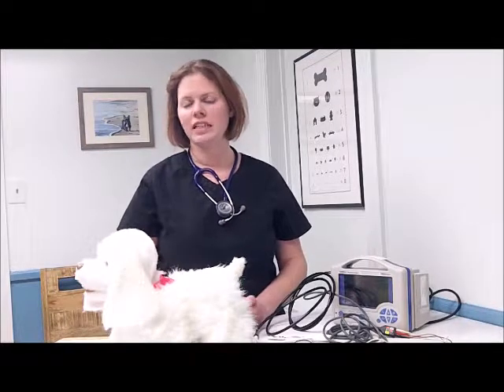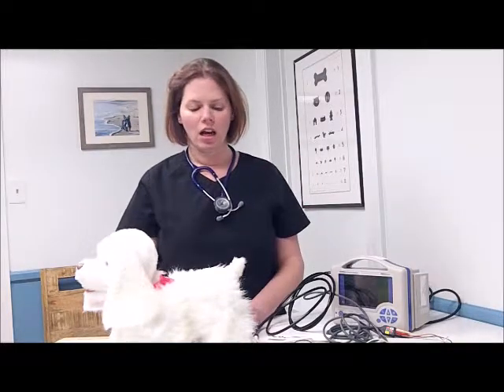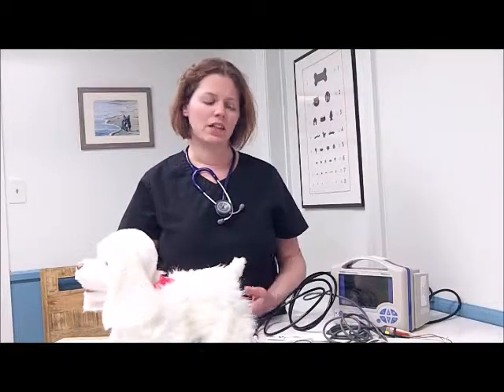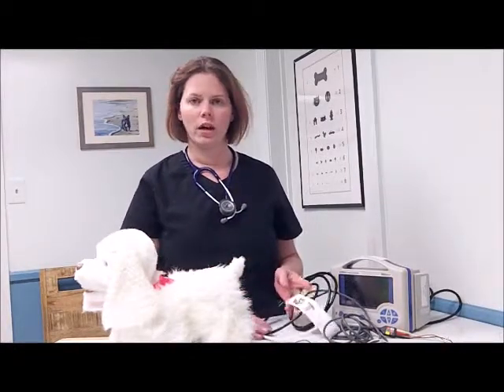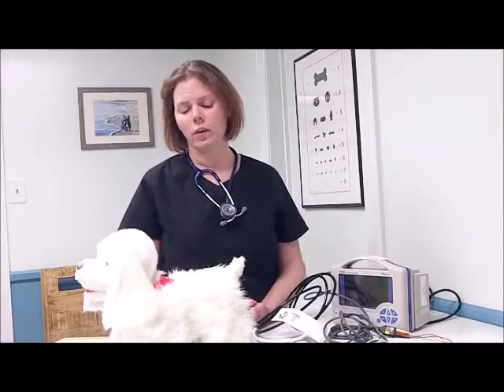Monitoring the physiological status of a patient under anesthesia is incredibly important to have a successful induction procedure and recovery from anesthesia. Most animals are going to be hooked up to monitoring devices such as an ECG, an electrocardiogram, that can have blood pressure monitoring with it as well. But understanding what those values mean and how they correlate with the planes of anesthesia and how your patient is responding to the procedure are vitally important as well.